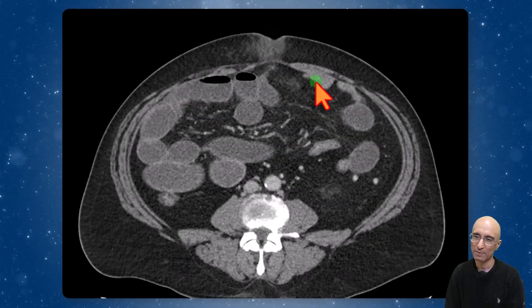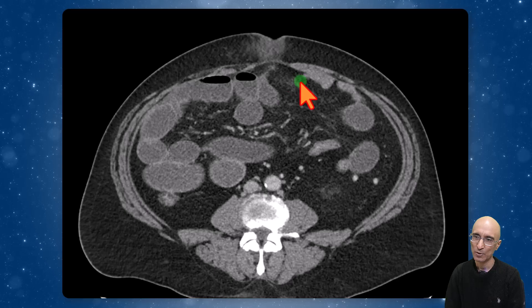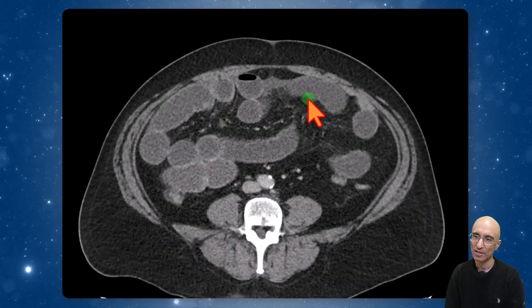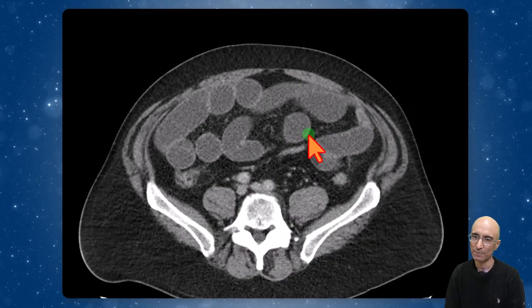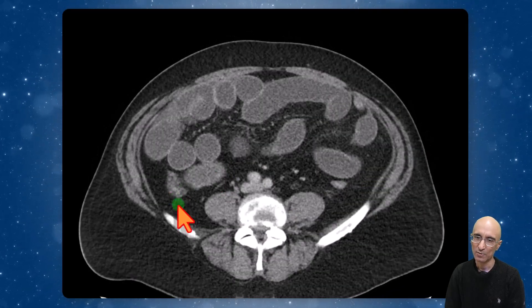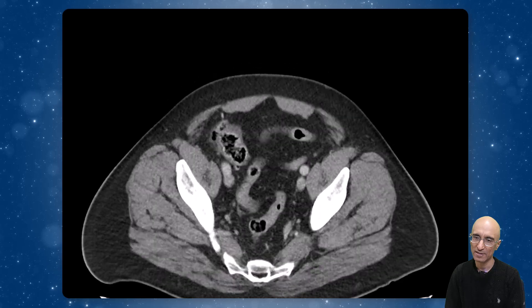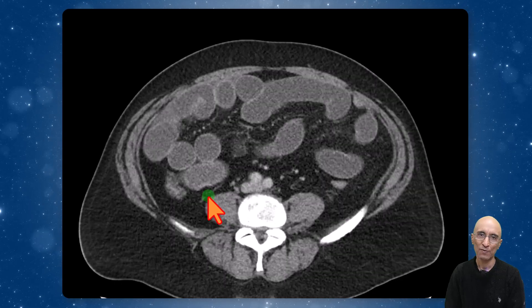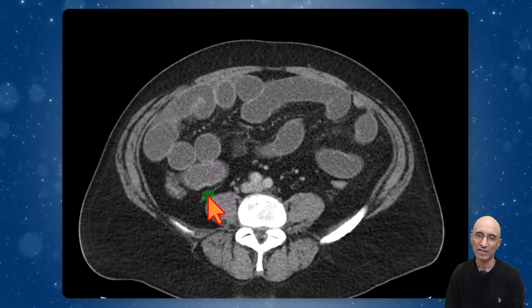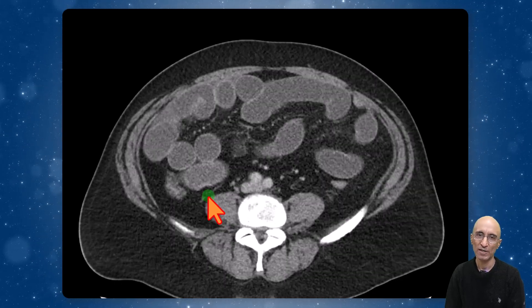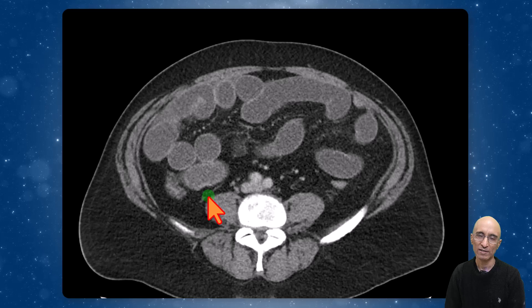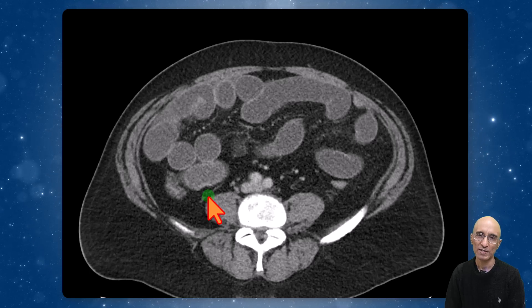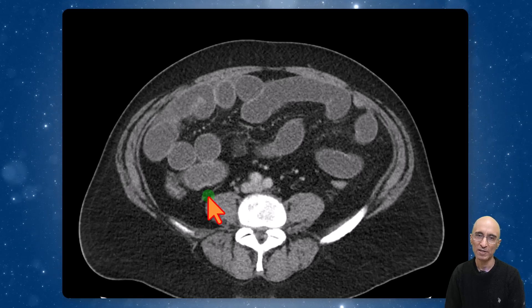The distal bowel loops beyond the hernia sac are all decompressed, and the large bowel is decompressed as well. These findings are concerning for umbilical hernia incarceration causing small bowel obstruction.